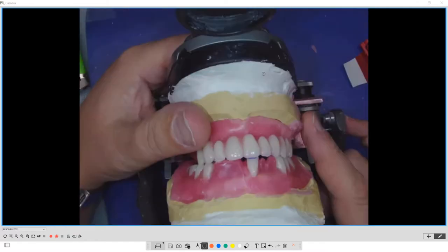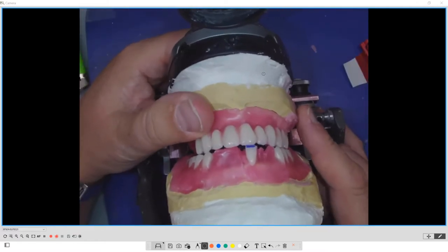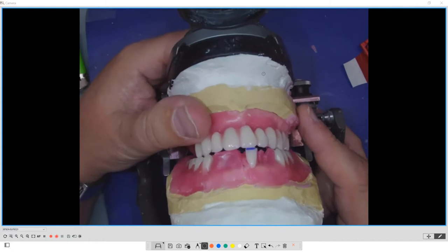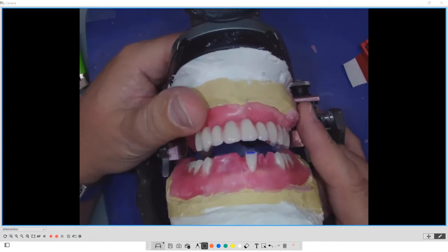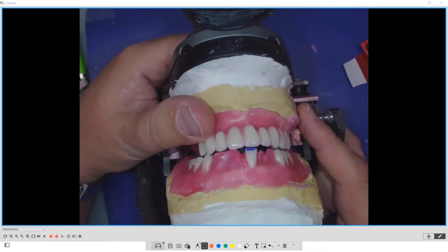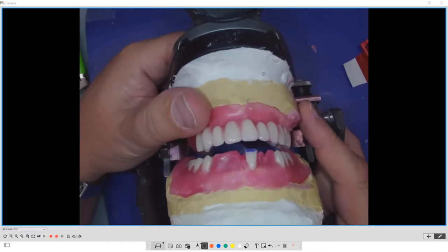That's another thing I've realized in my humble career. I am not shooting for end-to-end contact anymore, okay? But that's a whole other course that we can take. If you'd like to see an anterior tooth setup course, please write that in the comments section or let us know, and I can draft an anterior tooth setup course. And then once we can travel again, we can do it in person.